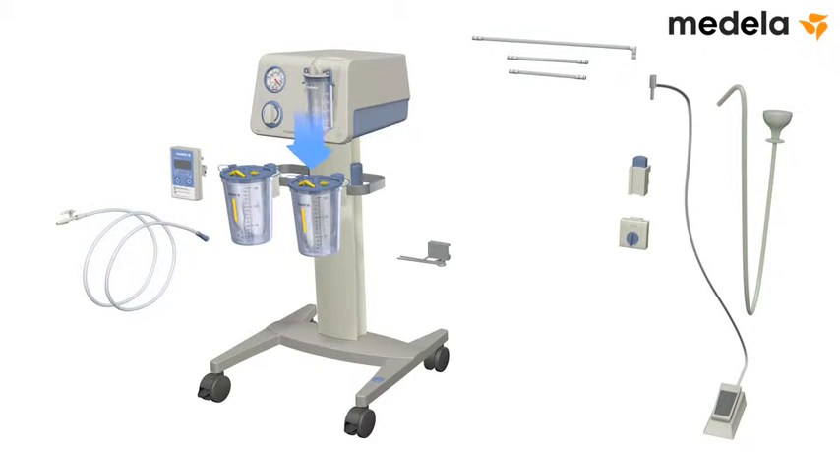Attach the changeover valve to the rail between the two jars. Connect the tubing from the changeover valve to the vacuum ports of the suction jars.